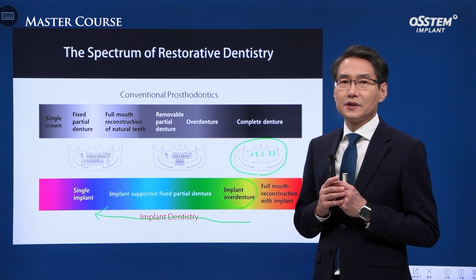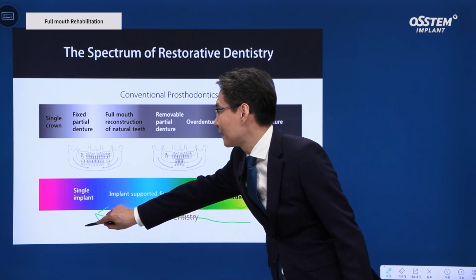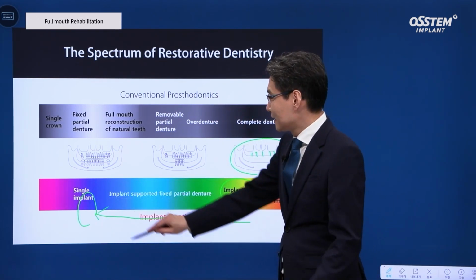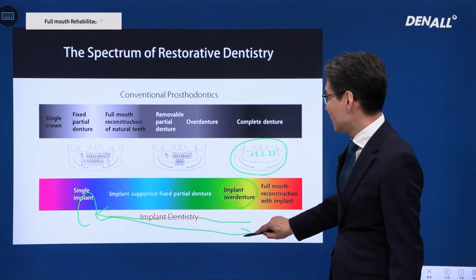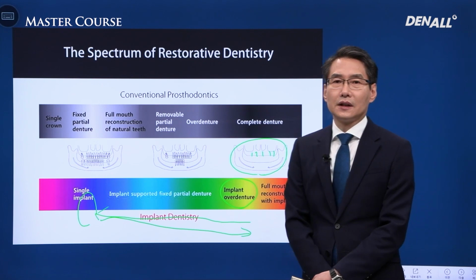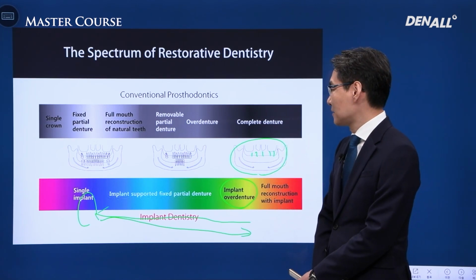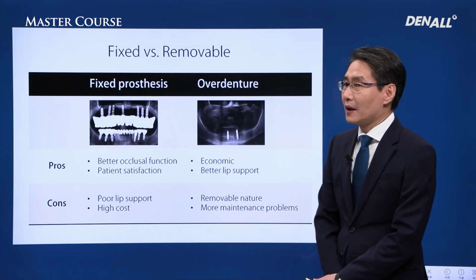If you look at how individual dentists learn about implant, the order is absolute reverse. They start off with comparatively easier single implant cases, moving on to partial edentulous cases where multiple implants are placed, and after sufficient amount of experience and knowledge is garnered, they move on to fully edentulous cases.